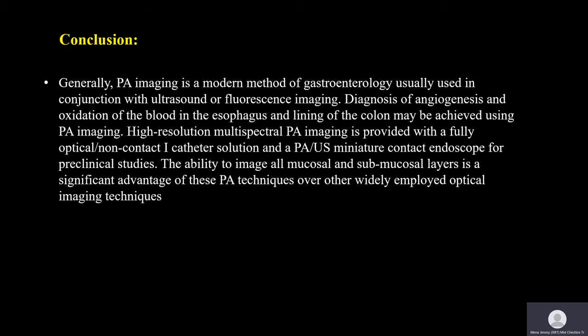images, but in the specialties and fields I have just talked about briefly because of the time limit, I think it is still doing its job, detecting any mucosal or submucosal changes earlier than any other modalities, to detect any cancer changes or any other changes regarding the specialty organ. So the ability to image all the mucosal and submucosal layers is a significant advantage of these PA techniques over the widely employed optical imaging techniques.